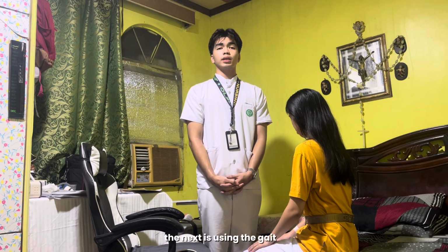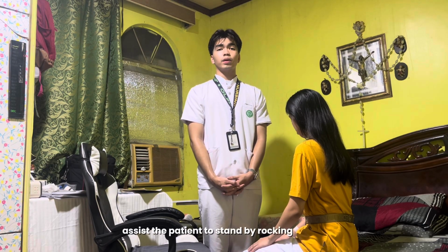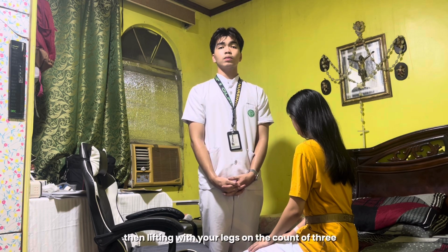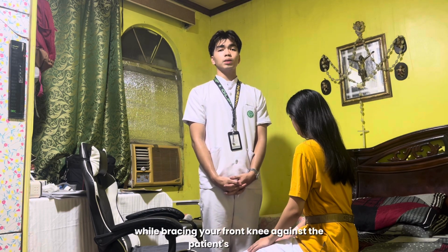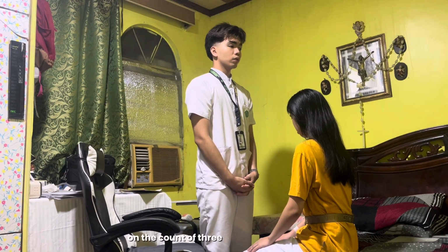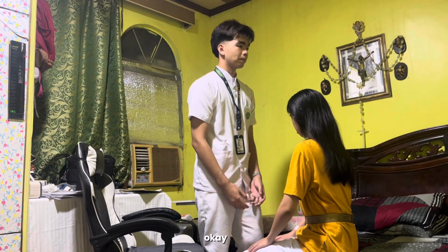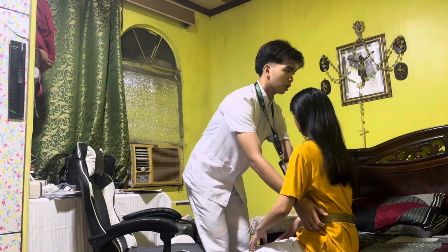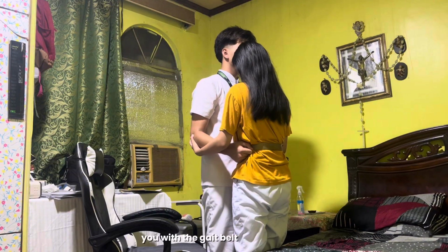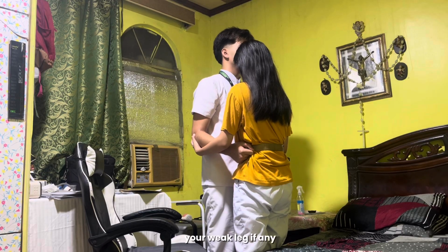Then next is using the gait belt, assist the patient to stand by rocking back and forth and counting to 3. Then lifting with your legs on the count of 3 while bracing your front knee against the patient's weak leg if indicated. So now ma'am, on the count of 3, I will assist you to stand, okay? Ready? 1, 2, 3. I am supporting you with the gait belt and bracing your weak leg if any.